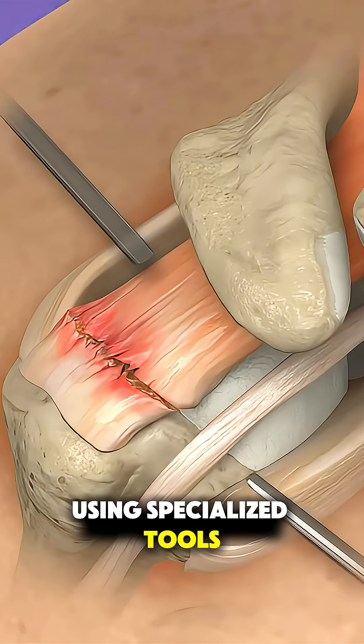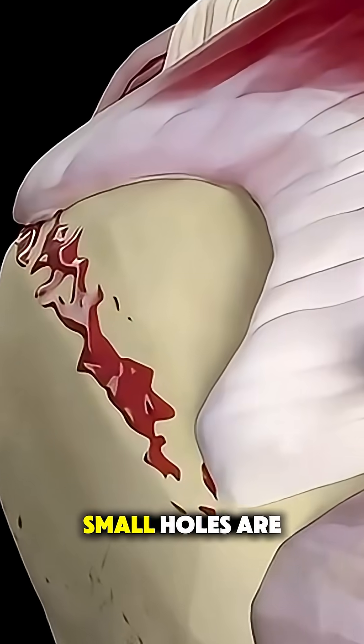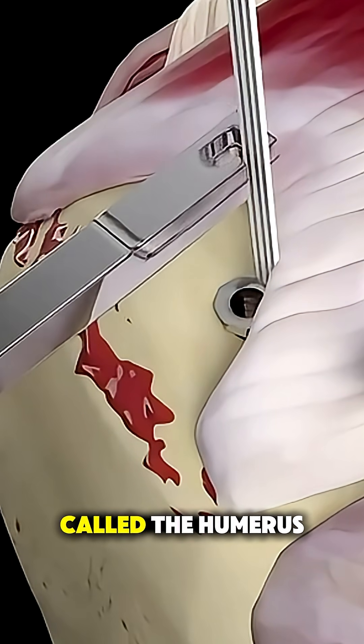Using specialized tools, they clean the torn edges of the tendon and remove any damaged tissue. Small holes are then drilled into the top of the upper arm bone, called the humerus.